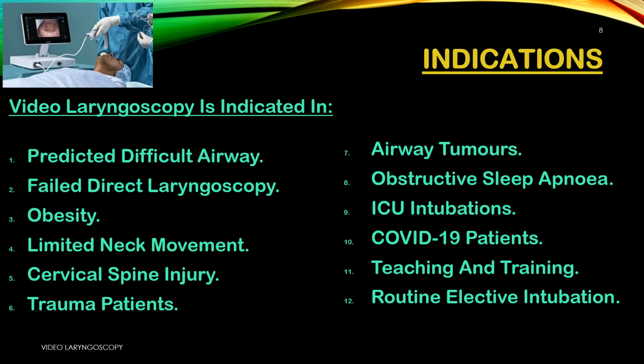Indications. Video laryngoscopy is indicated in: 1. Predicted difficult airway. 2. Failed direct laryngoscopy. 3. Obesity. 4. Limited neck movement. 5. Cervical spine injury.